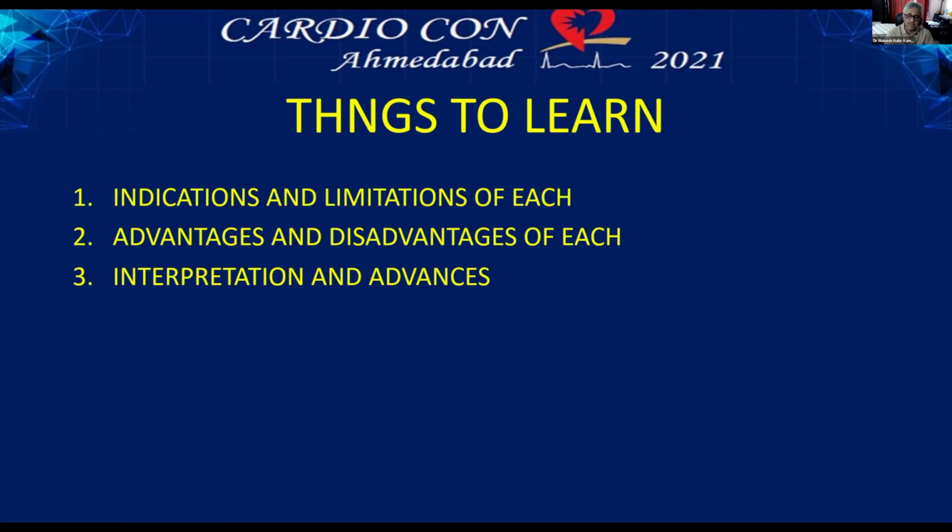It's absolutely mandatory in left mains and bifurcations, so that we'll be able to give a better result and the TLF can be reduced. Again, the concept of imaging with ISR angioplasty and no imaging with ISR angioplasty will not take off. It is not fair. That's what I felt. Thank you, Dr.